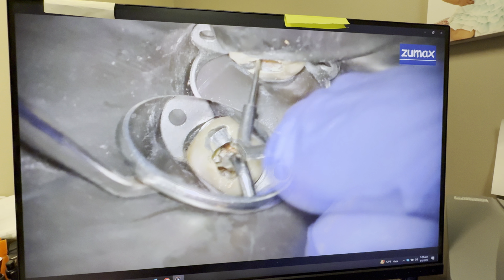Remember, this dentist had filled short. The canals that he had found, he had filled short. So there's a reason why the canals were filled short, and you can see why they're blocked, perhaps by debris and leftover pulp tissue.